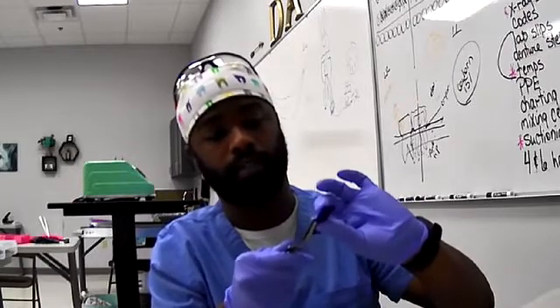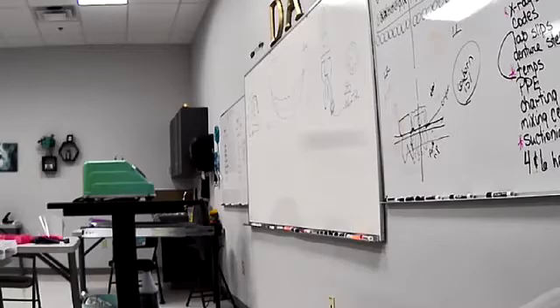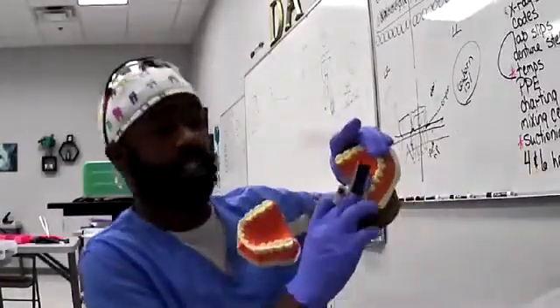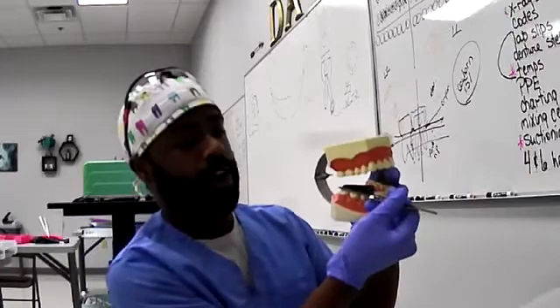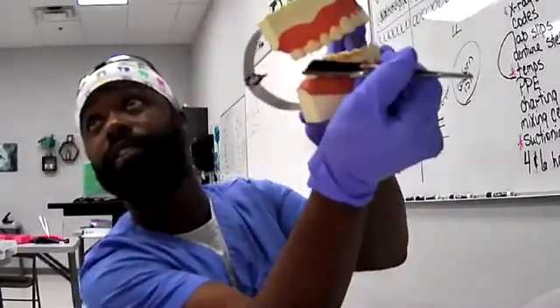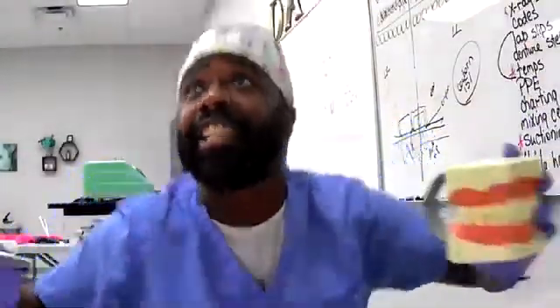So after fillings, you want to check your bites. Basically, what that is, let me show you. Sorry. All right, whenever you check your bite, you want to check the occlusions, which are the biting surfaces, remember? So you would put it into the patient's mouth, right on that surface that you did. Tell them to bite down, bite just like that, onto the paper. You tell them to tap their teeth, tap, tap, tap, and then get them to grind their jaw kinda side to side like that. So it's tap, tap, tap, grind, grind, grind.